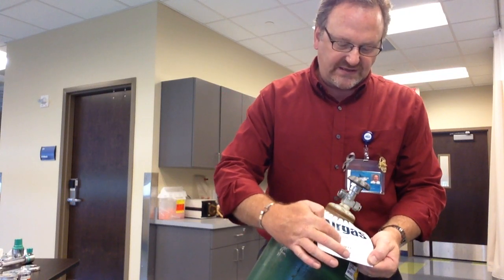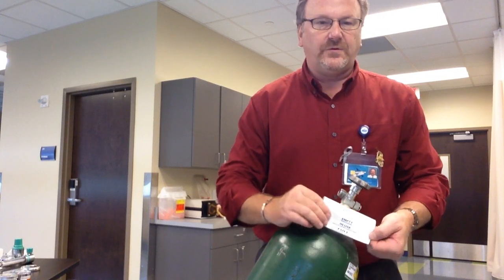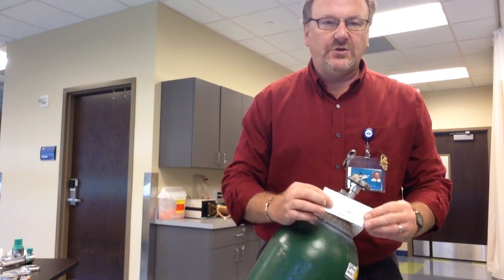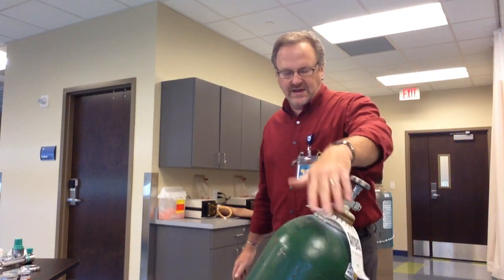Jumping back real quick — you see the tag here: empty, in use, full. When you open a tank and start to use it, you need to rip off the full tag and then it's in use. When it's empty, you rip off the in use tag and it stands empty. This is how you know what level your tank is.